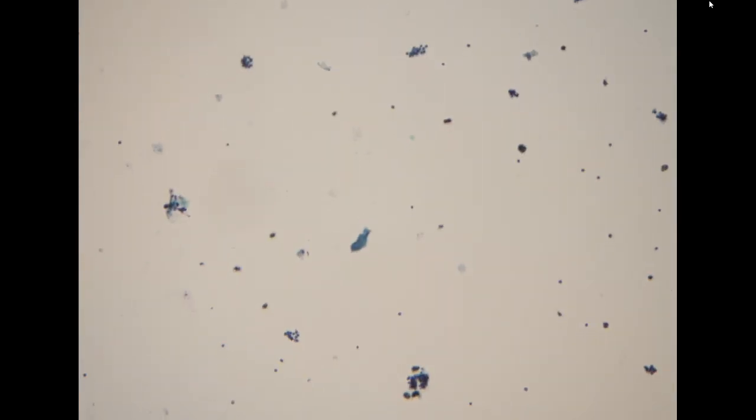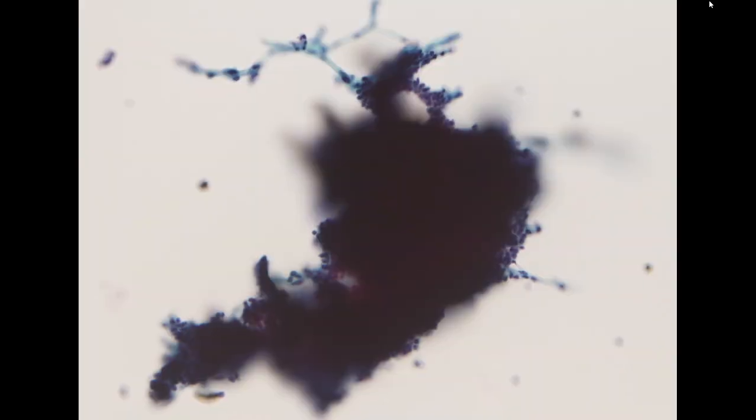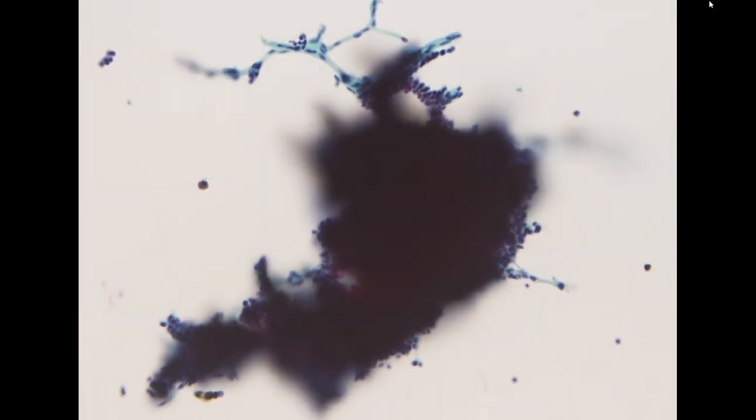These morphological features are very typical for a parathyroid lesion. In a parathyroid lesion, again, the background is usually very clean. You won't see colloid because it's not thyroid, and you will see very cohesive three-dimensional fragments, oftentimes with papillary architecture. It is very common that you can see the capillary meshwork.